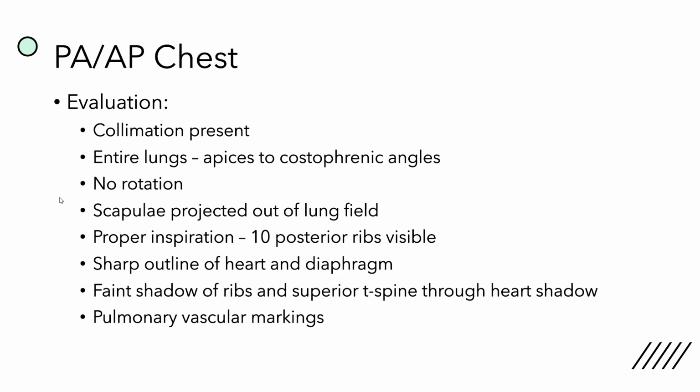You want to make sure that the patient's not rotated at all, that they're facing as far forward as possible, and that they're as close to the imaging receptor as possible. You don't want there to be any gap between them and the imaging receptor. If there's a gap, that can cause magnification, and as we know, that's not good.